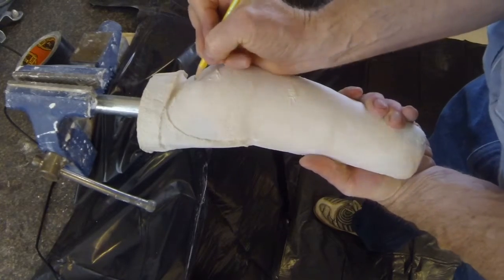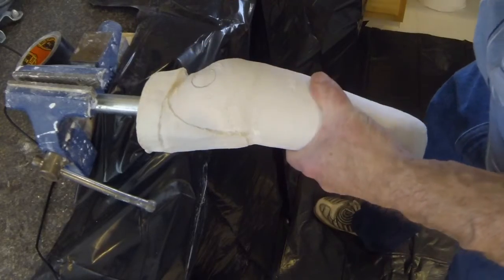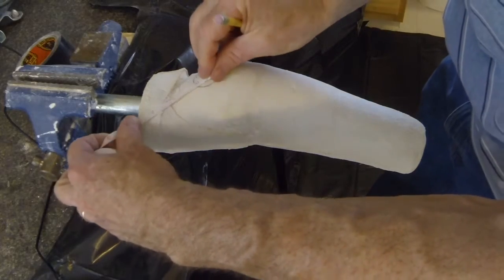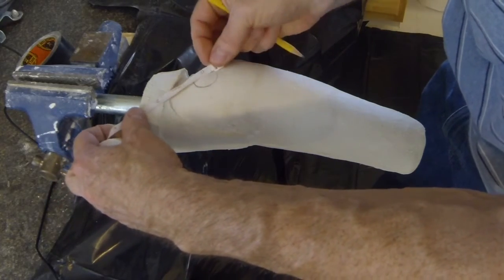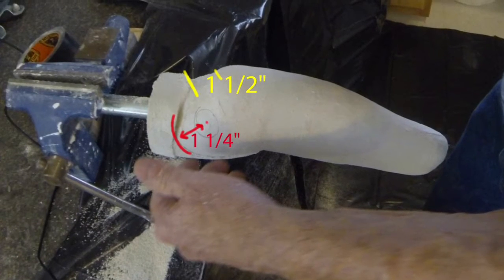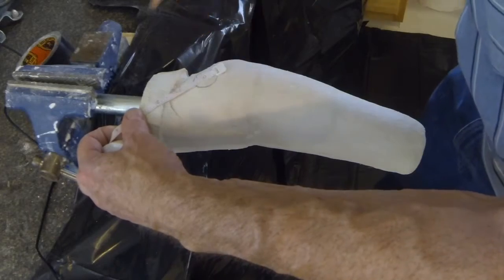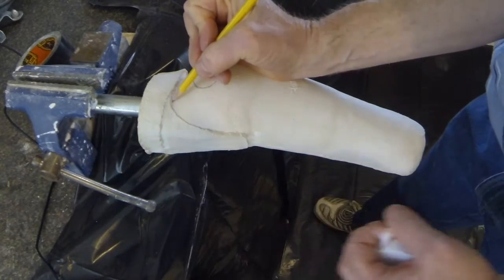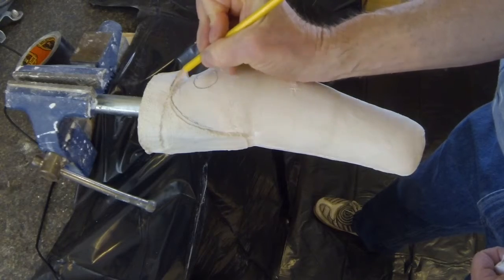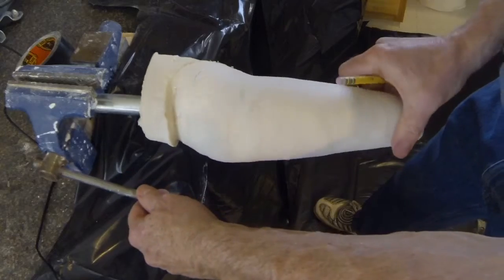Here we see the plaster cast taken in the manner demonstrated in another video. First, mark the location of the epicondyles and proximal border of the olecranon. The medial and lateral wall height should be 1¼ inch proximal to the epicondyles. The posterior wall height will be approximately 1½ inch proximal to the olecranon. Posterior wall height may be greater for very short residual limbs and lower for longer residual limbs. Trace out the desired trim lines as shown.